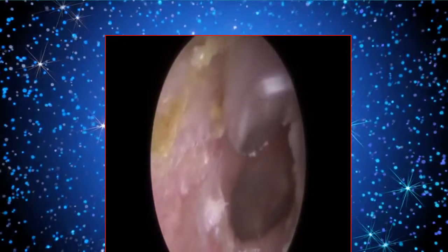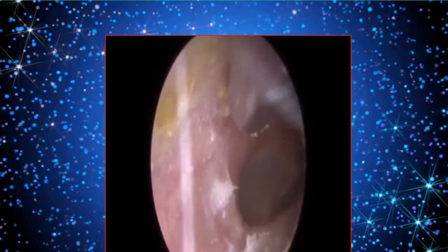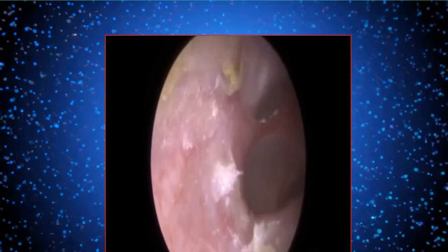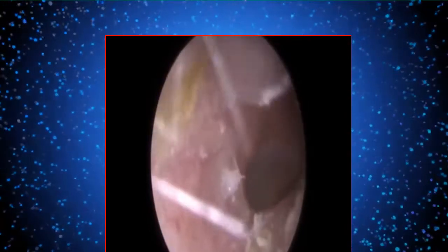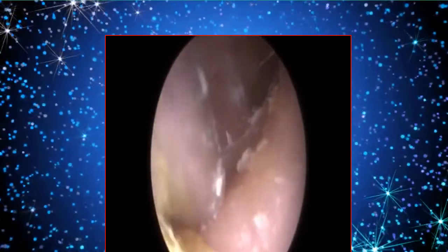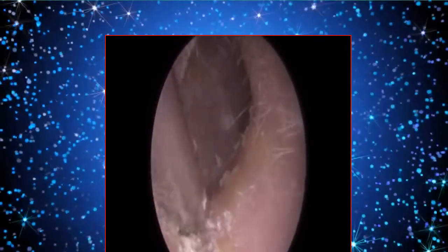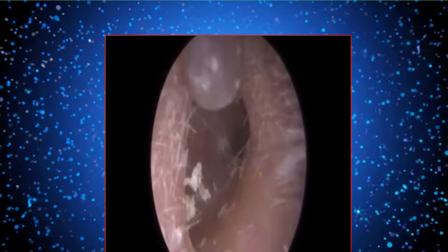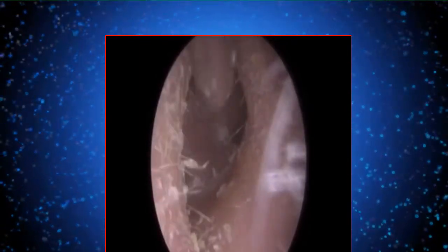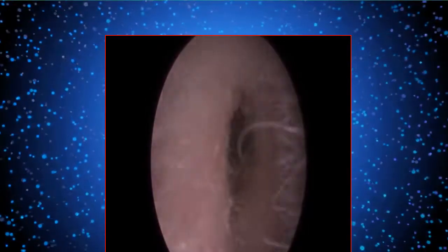I'm just using the suction probe to extract some of this dry skin the patient's got around the ear canal wall. You can see how dry it is. The eardrum itself is intact and very healthy. This patient's otitis externa is more lateral — it's near the entrance of the ear, as opposed to more medial towards the eardrum. The patient advised that he was using a lot of water when showering, bathing, and submerging his head, using the shower head to almost rinse the ear out like a jet wash — a DIY self-syringe irrigation. I've advised against that. We want to avoid water in the ear, as water can cause otitis externa, which can lead to some serious ear infections.